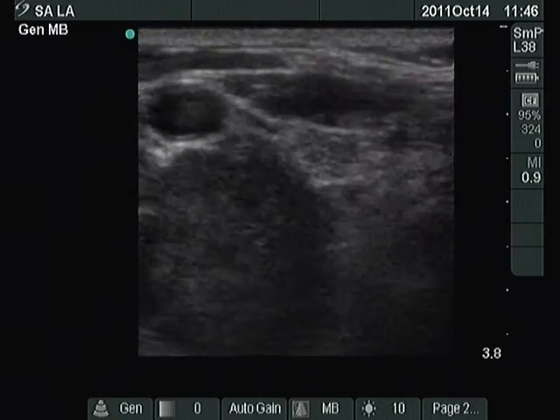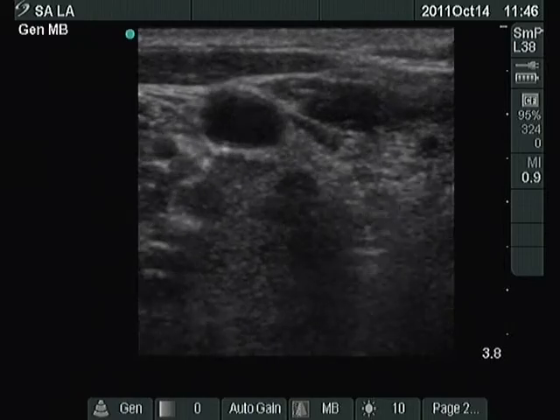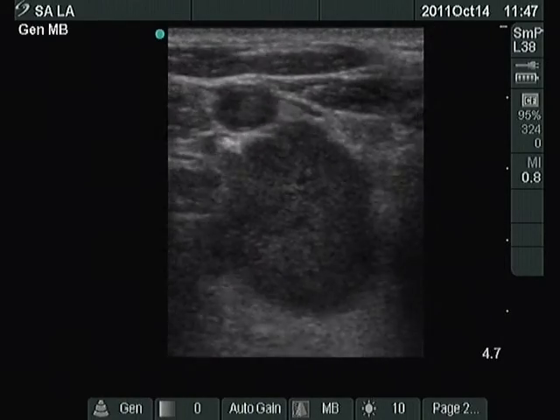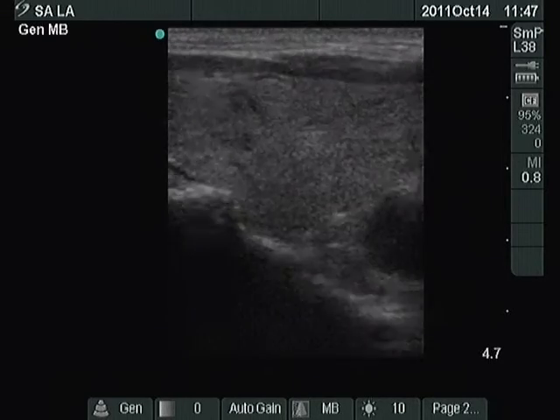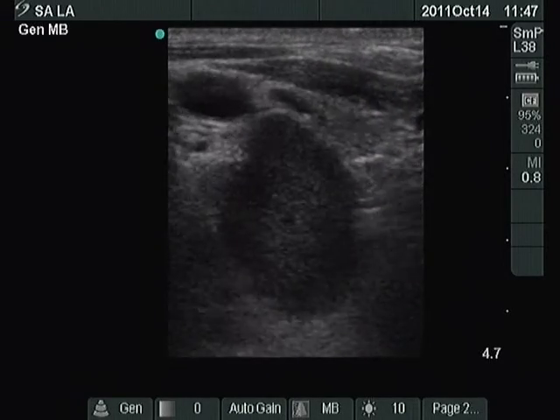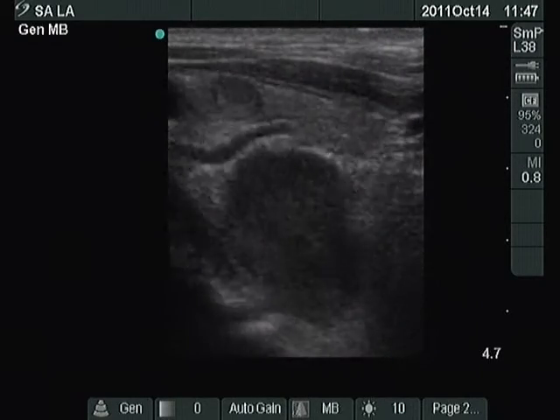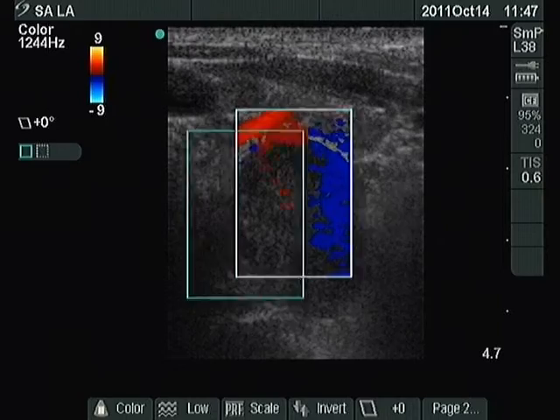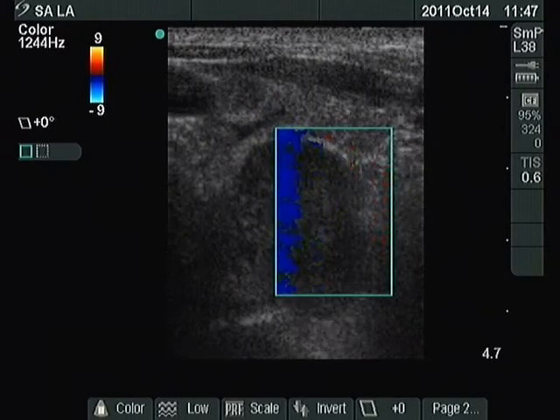Right thyroid, horizontal view with the tumor in the dorsal lateral part of the lobe. We had to reset the depth in order to visualize the entire mass. Note the surface irregularity of the lesion. The small hypoechoic discrete areas in the ventral part of the lobe have no clinical significance. The vascularization is not specific, decreased.